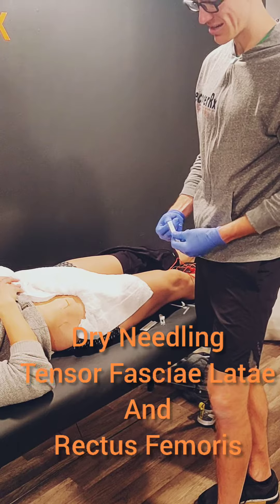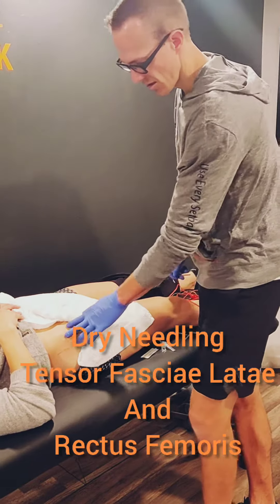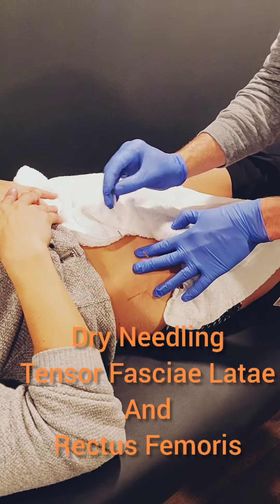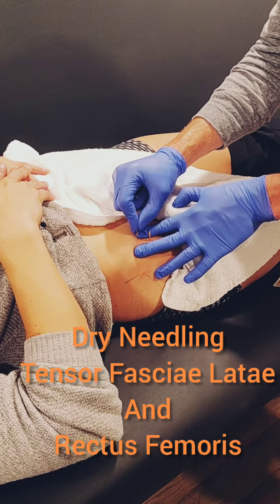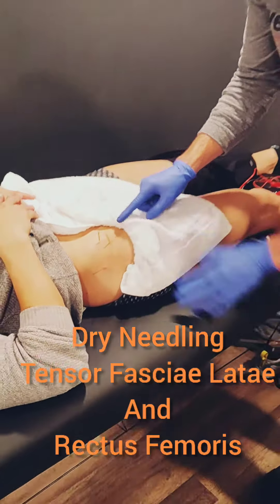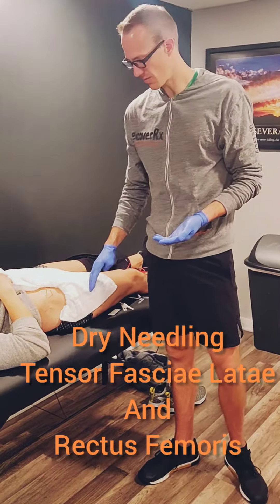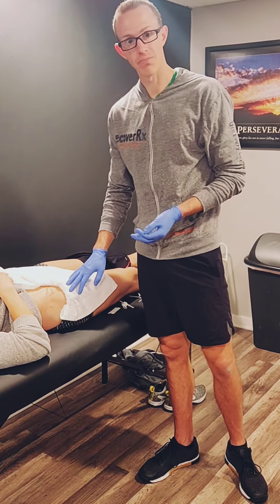So two hip muscles right there on the anterior aspect of the hip. The last one I'm going to address is a little bit deeper — not as bad, more tenderness up here, so not as many twitches. Anterior dry needling for the hip — really good for resetting muscular function, helping with performance, and also decreasing some pain in that area.